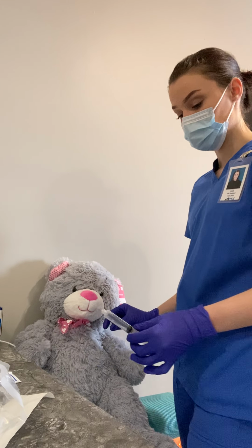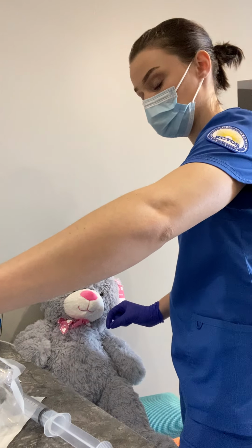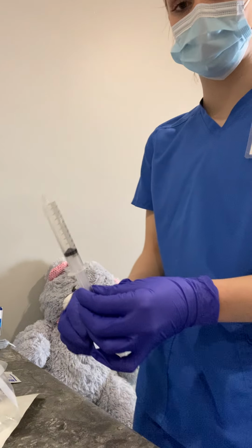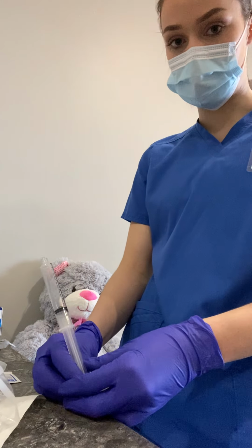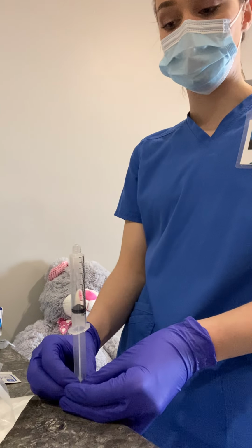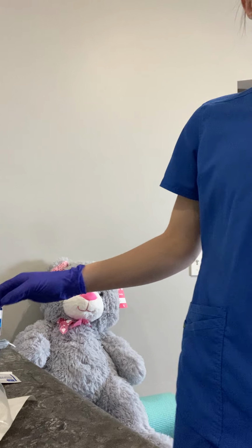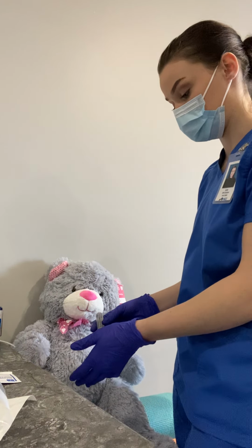All right, so I've got that. I'm going to set this, and then I'm going to connect my normal saline and leave that normal saline connected. For my 10 mLs of blood that I got for my sample, I'm going to put this in the correct vial. I'm going to date it, initial, time it, and send it to the appropriate place it needs to go, whether it be lab or whatever. I'll have that done. So I have my normal saline connected. I can go ahead and flush my normal saline through.